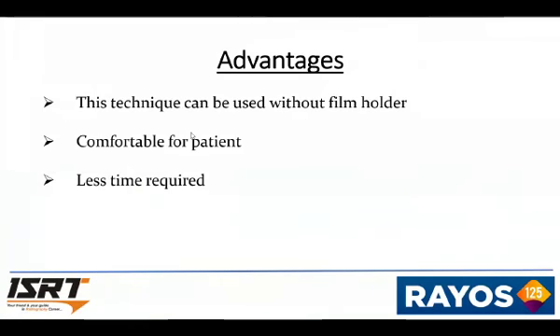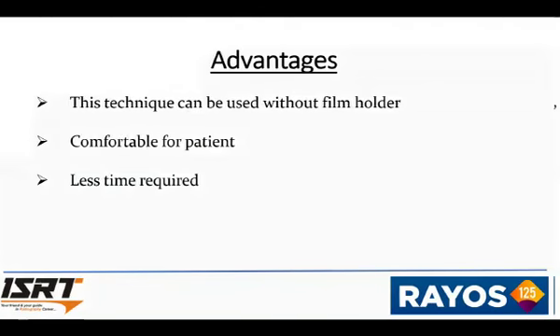So the advantage of this technique is that it can be used without a film holder. It is much more comfortable for the patient, and patient positioning requires less time. We need not use any film holder, so the film holder need not be sterilized, etc. So these are the advantages.